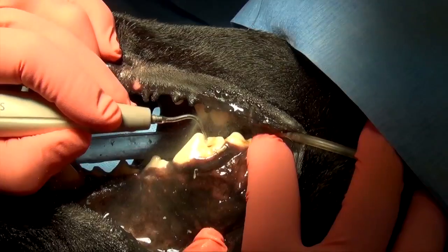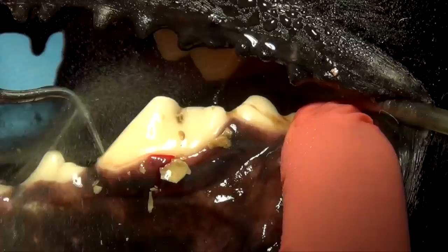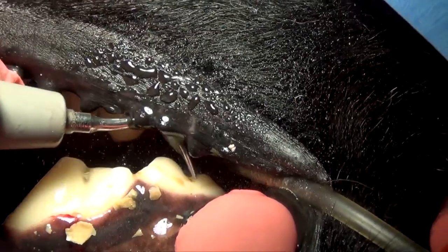With most ultrasonic scalers, you should have two tips that you're going to be using. One is specifically for the crown. The other is specifically for subgingival ultrasonic cleaning. So make sure that you've got the correct tip on if you're going subgingivally.